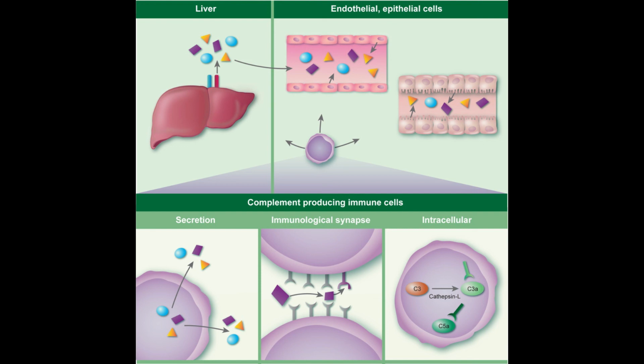Several laboratory assays have been devised to detect abnormal complement levels, one of which, the CH50 hemolytic assay, uses 50% lysis of a standard concentration of antibody-sensitized sheep erythrocytes as an endpoint. This measures the presence of all proteins involved in the classical pathway. A similar assay, the AH50 assay, measures the functioning of the alternative pathway. Other assays using RID or ELISA techniques measure levels of individual components. Proper handling of specimens is essential to ensure correct interpretation of laboratory testing.